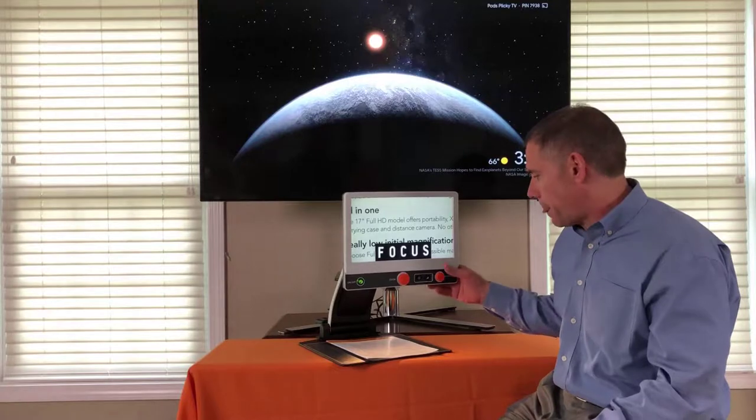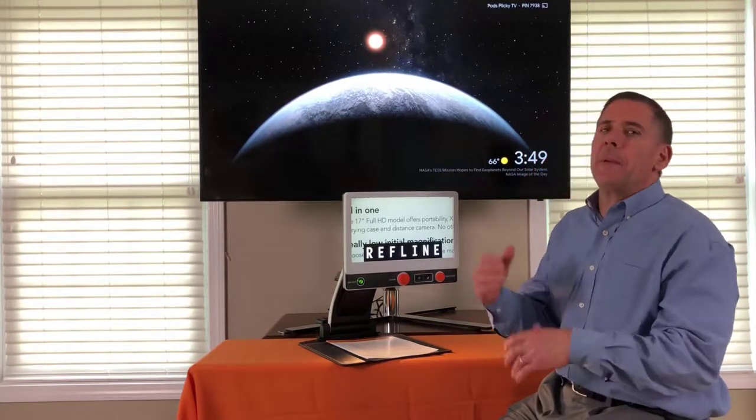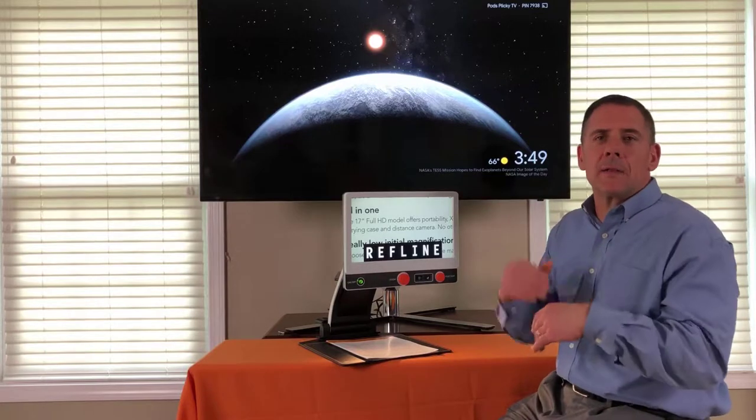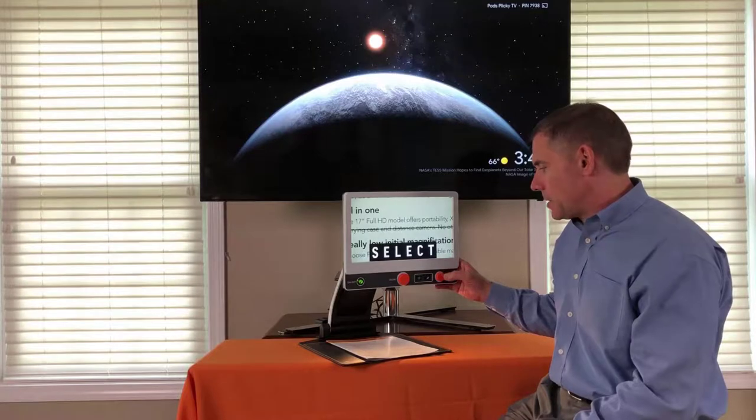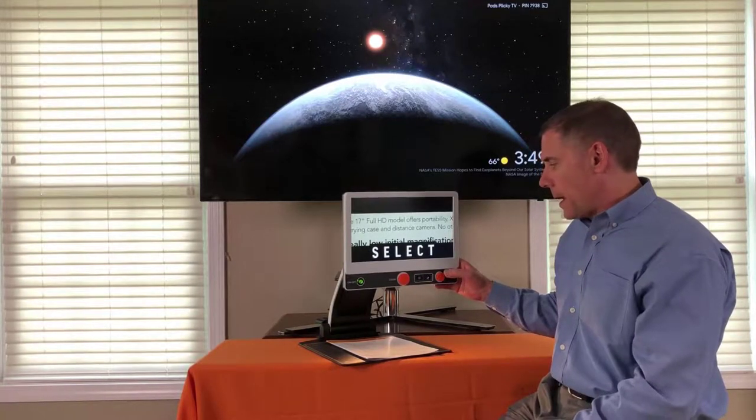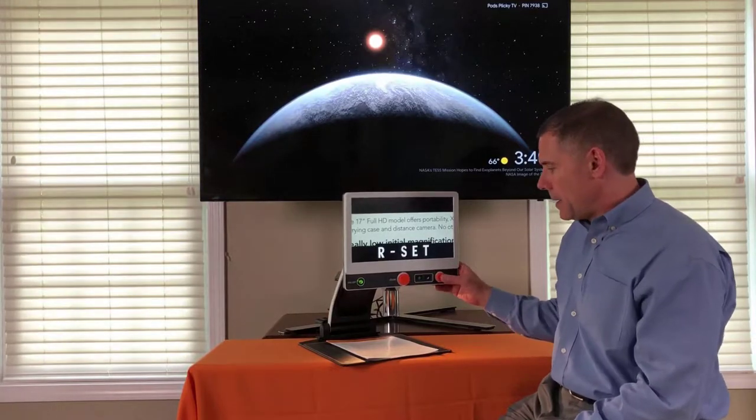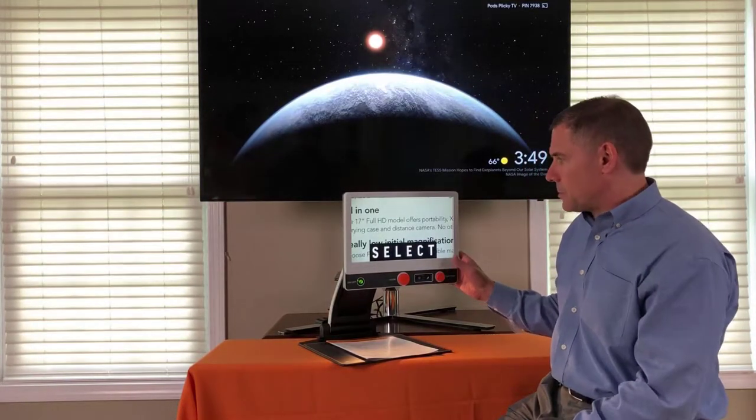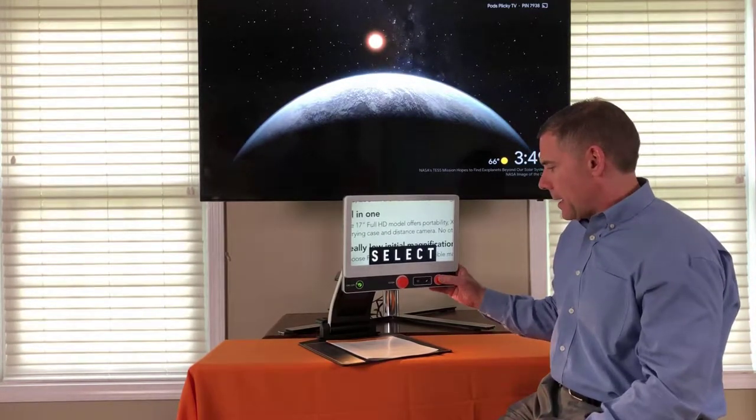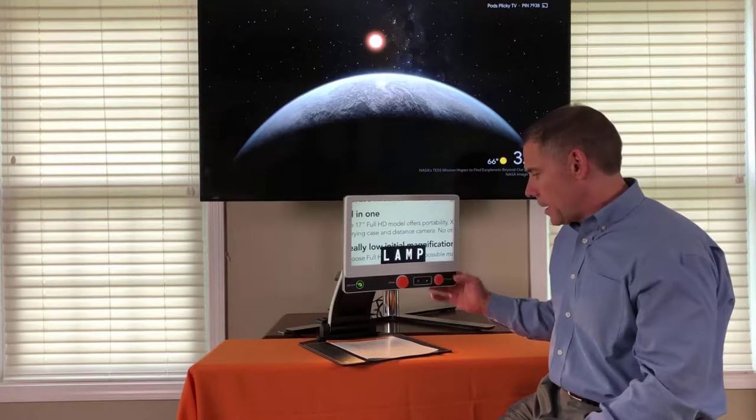My next function is reference line. That's basically vertical horizontal lines and mask. To activate it, I push it in and then I select the one I want to work with. Then I press in again and now I can adjust it. To get rid of it, I just wipe it off the screen and I'm good to go.